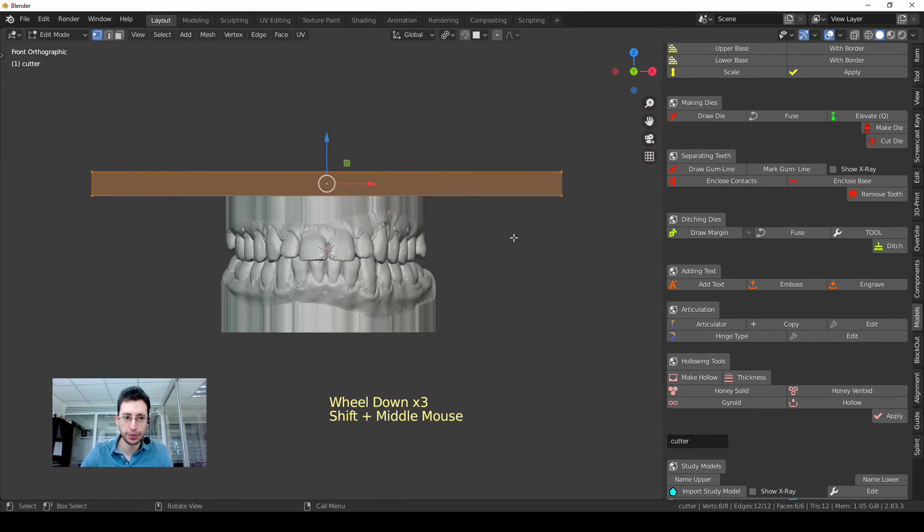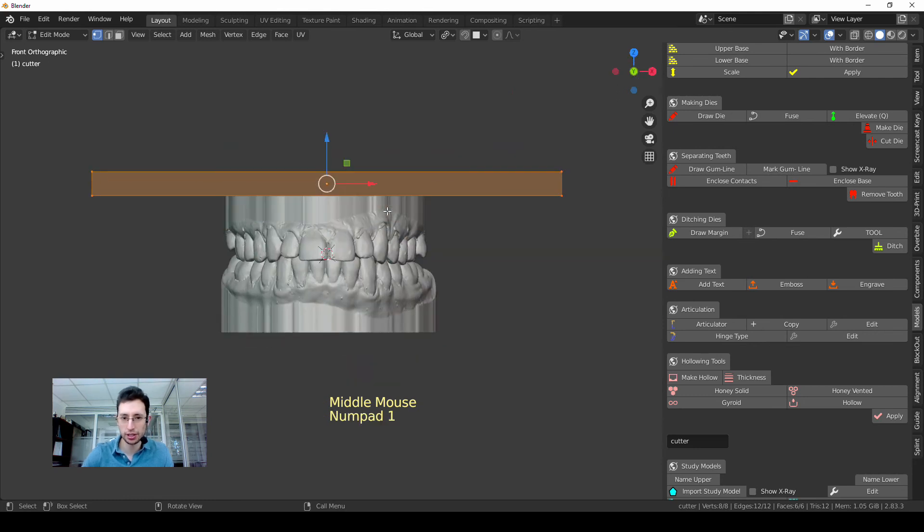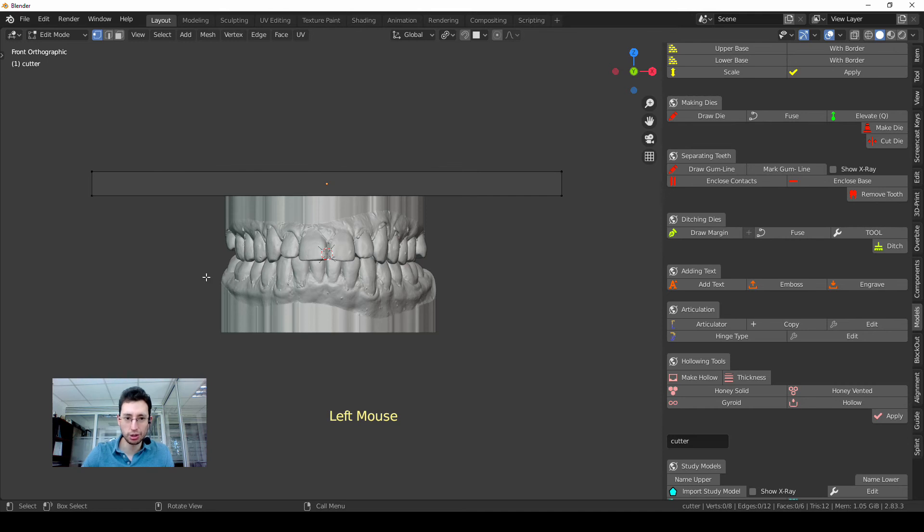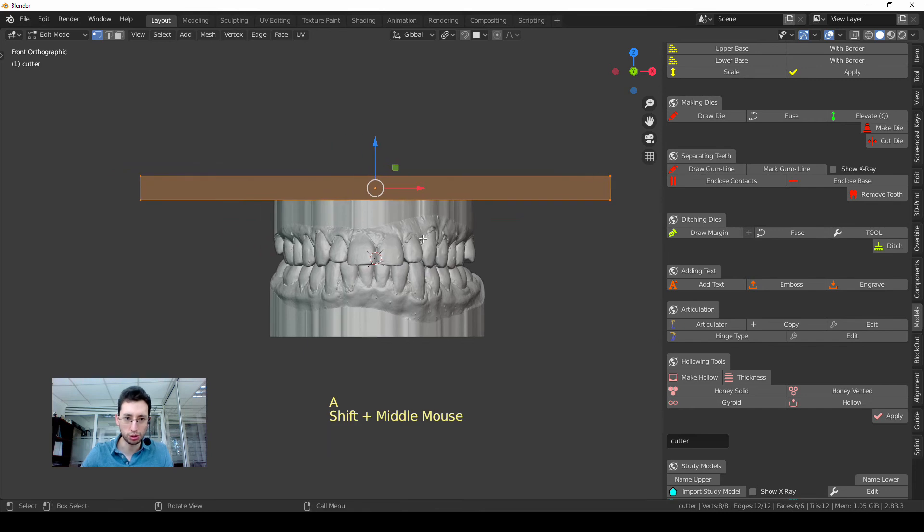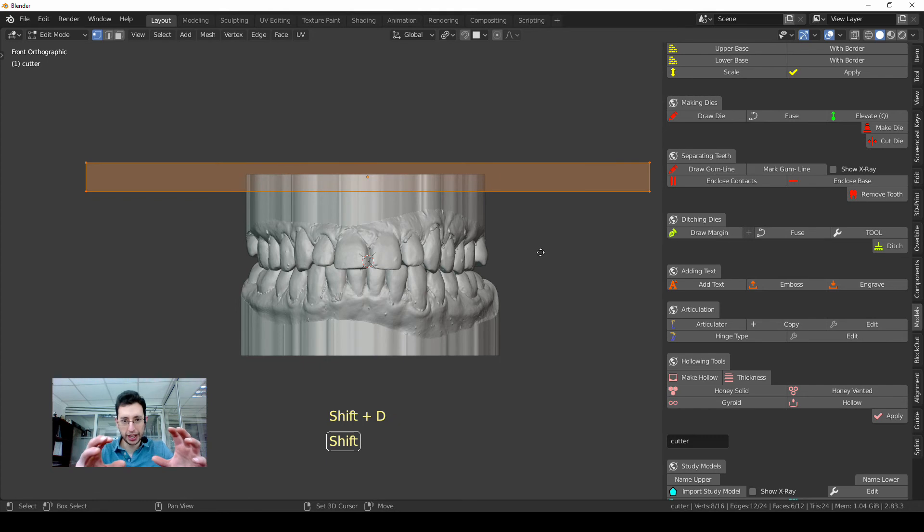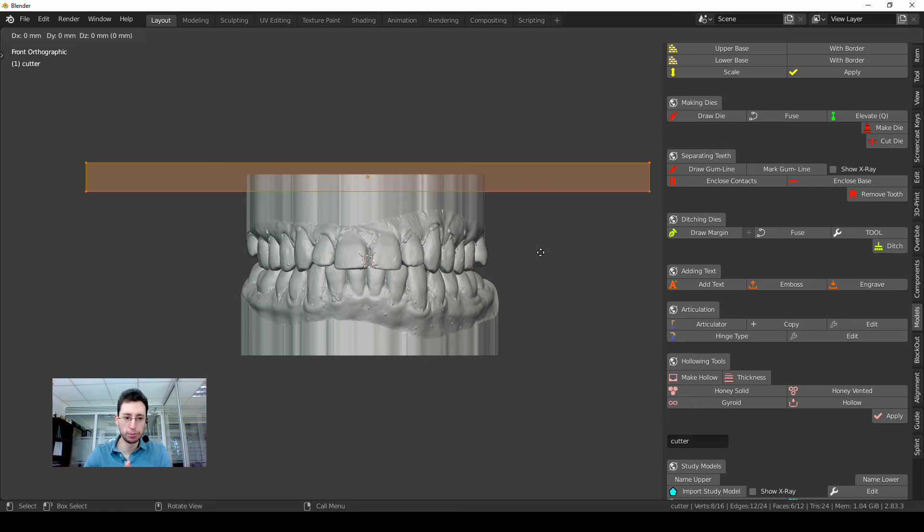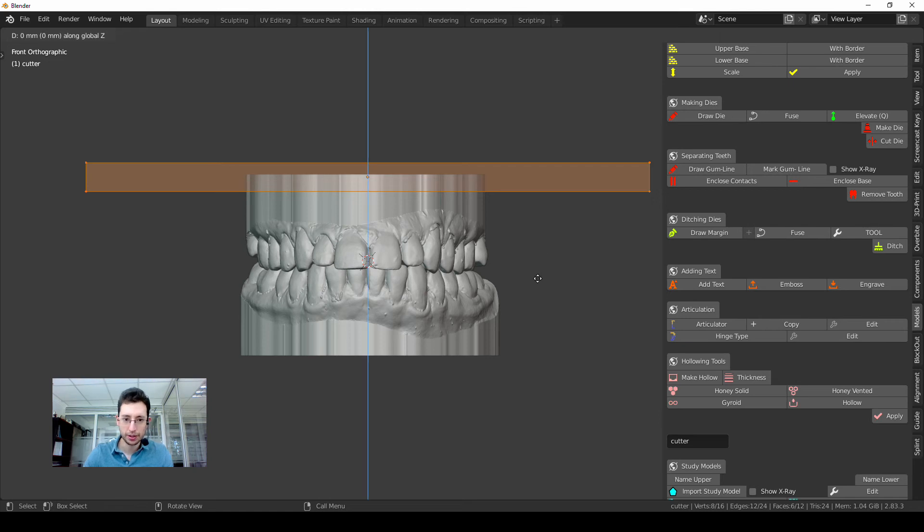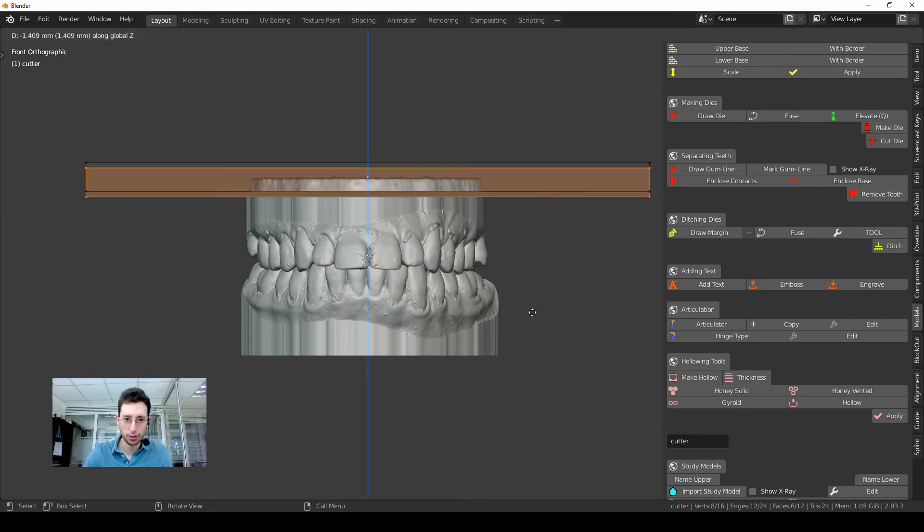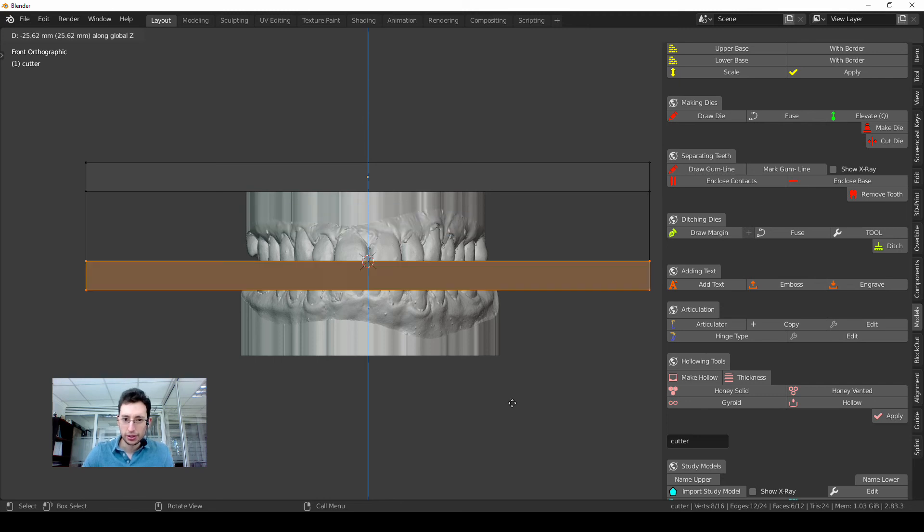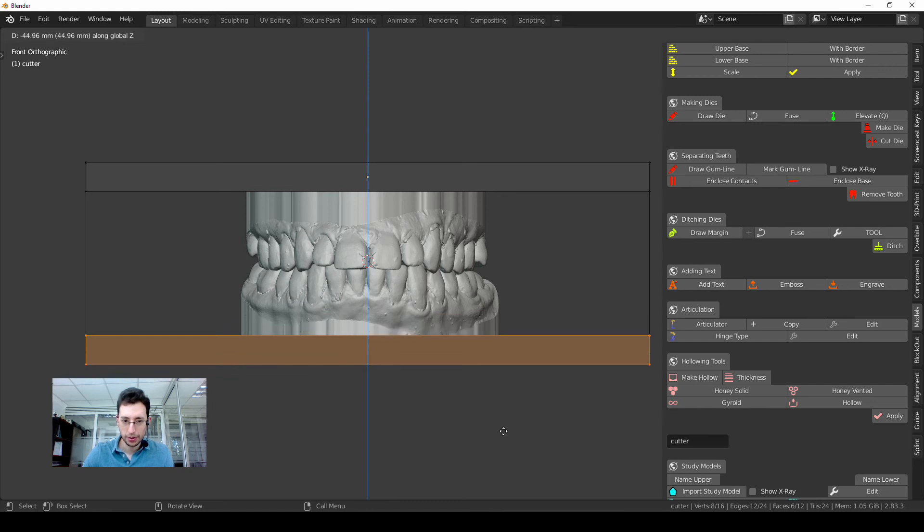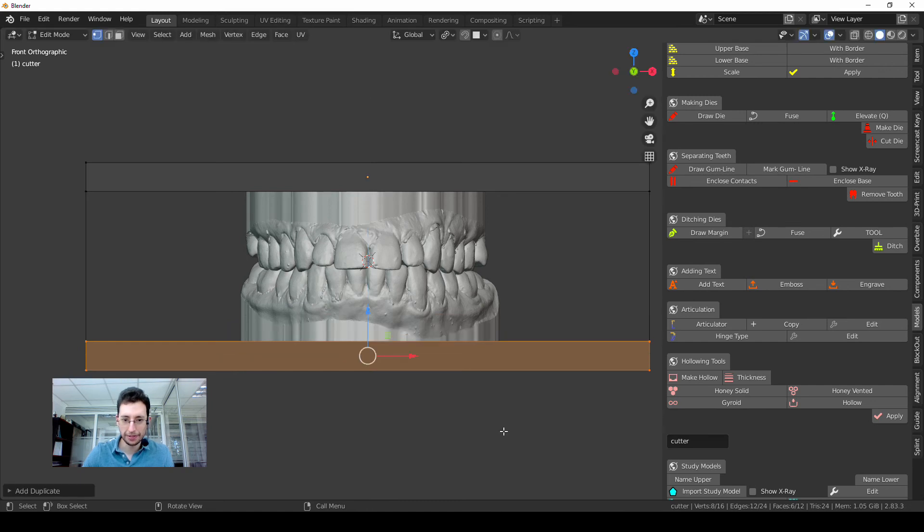Once you are in Edit mode, you have to be aware that everything is selected. As you can see, everything is orange, so that means everything is selected. If for any reason you unselect something, you press the key A and now you are good to go. So now I will press Shift and D to duplicate this part, the cutting part, and move it down. In order to constrain my movements to one specific axis, I press the key Z for the Z axis and move it down. Once I reach the bottom of the model, left click, and it's going to stop right there.